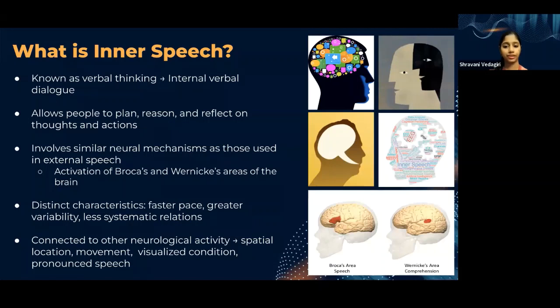Now, brain-computer interfaces, BCIs, are systems that allow individuals to communicate or control external devices using their brain activity. Inner speech has been proposed as a potential source of signals for BCIs because it is a form of verbal thought that the individual can directly access at all times. This topic is the basis of our research, but it is important to first take a look into the dataset we have used to conduct this study.